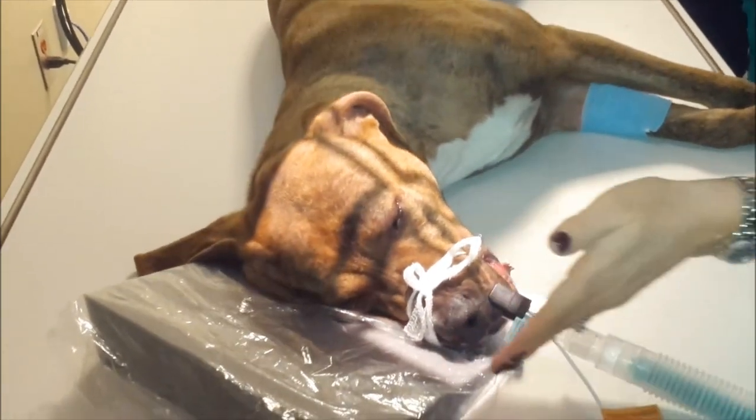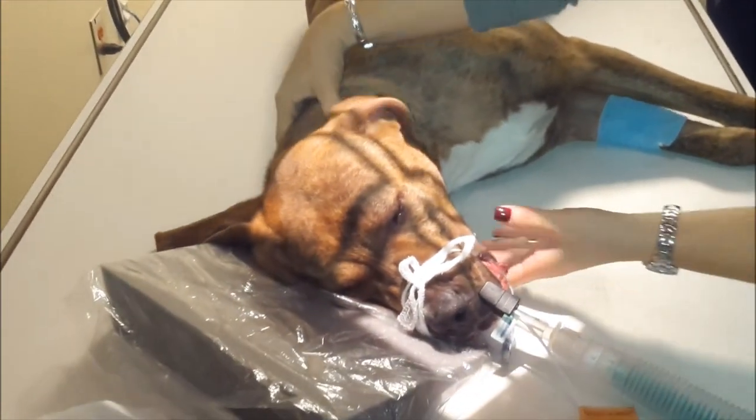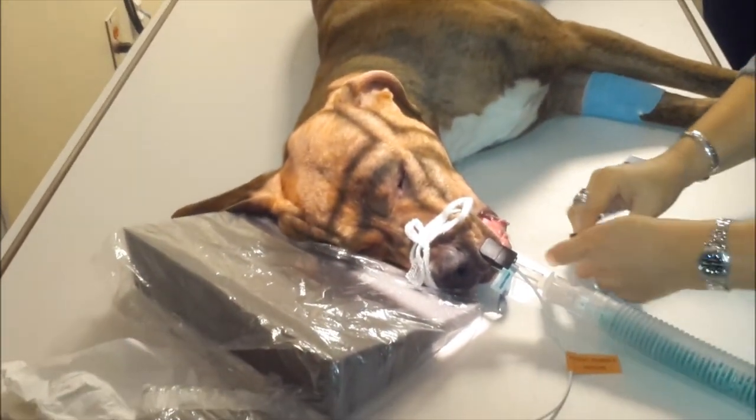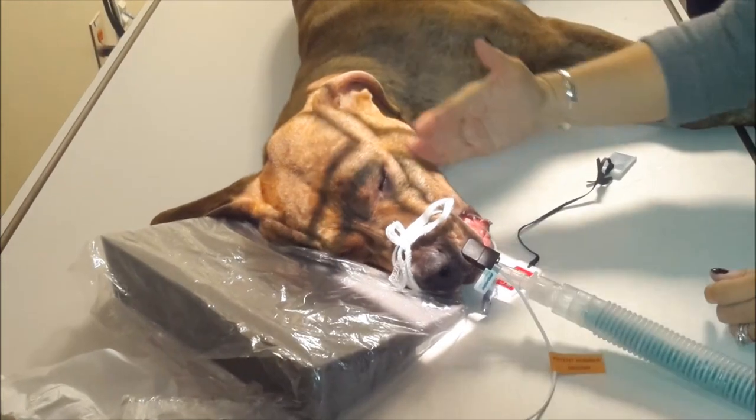Tip of the nose to the tip of the base of the skull — put your right marker in and measure across the thickest part.